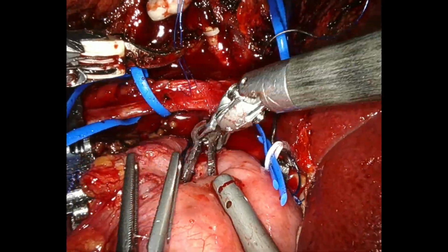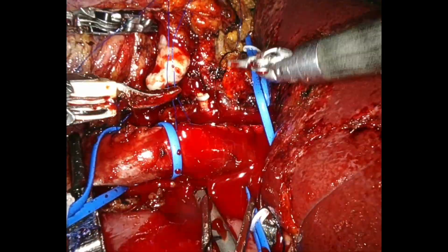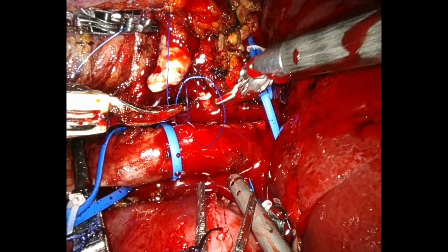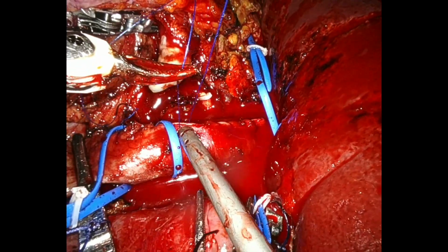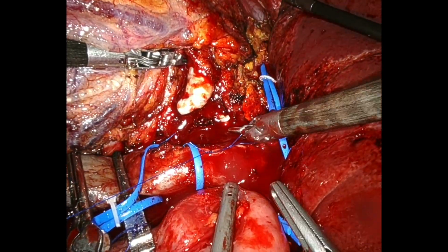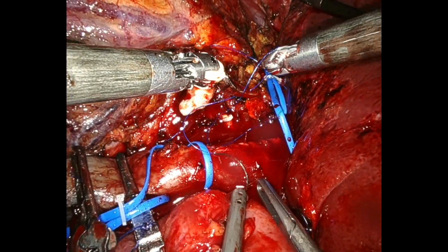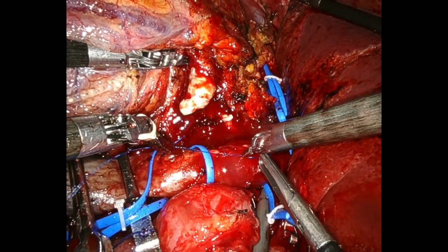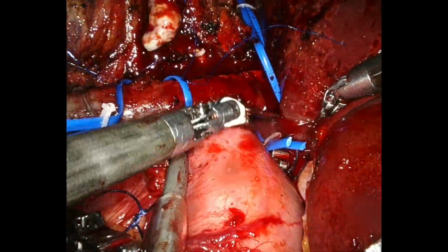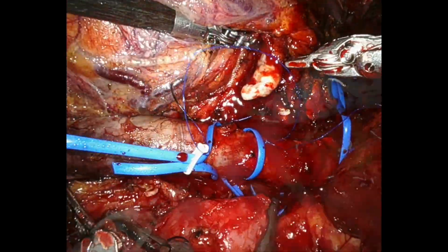Before complete sealing, abundant irrigation of the vena cava is performed and the left renal vein is unclamped in order to obtain blood backflow. Clamps are removed from the vena cava, and finally lymph node dissection and nephrectomy are completed and extracted in one piece.